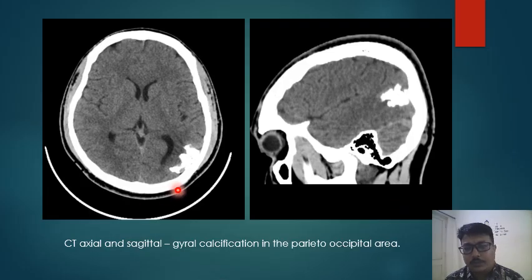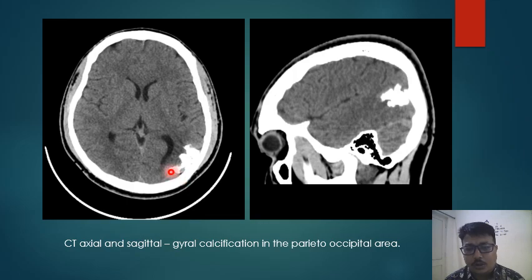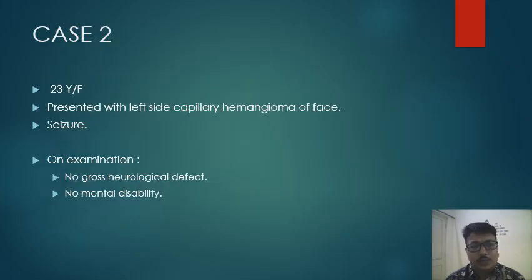CT scan of the same patient showed gyral calcification in the left occipital region.